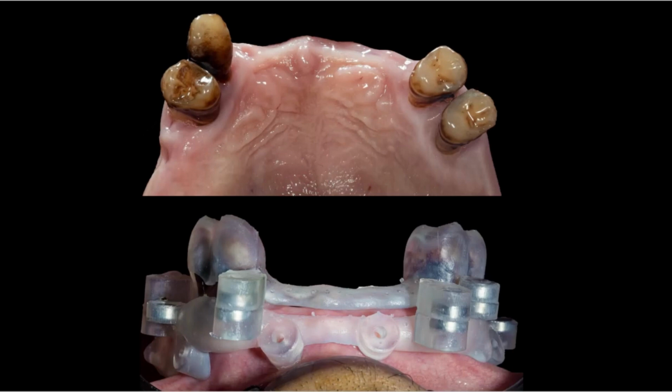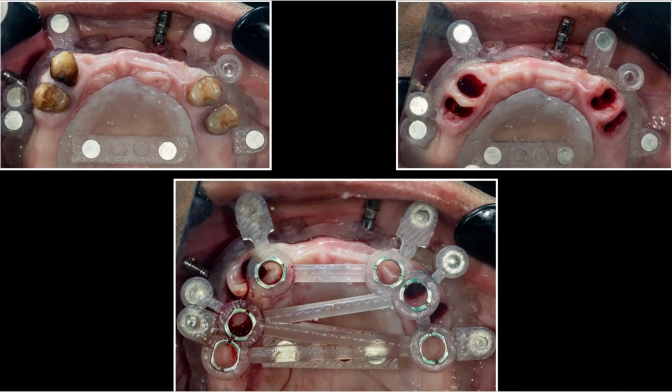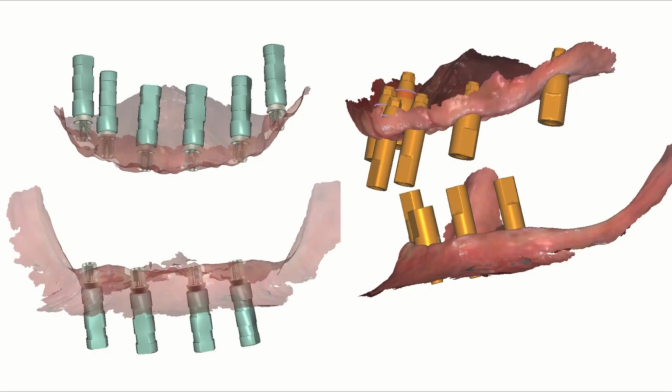These are clinical photos for the stackable guides in place. Usually stackable guides are used either when you need to extract all teeth and at the same time utilize them to make your foundation guide to support it, or make bone reduction before implant placement. And this is after extraction. Then we place the fixture placement guide. Note the parallelism of these prosthetically driven implants. This will positively influence the passivity and of course this will affect the longevity of your final restoration. So we get what we planned for.